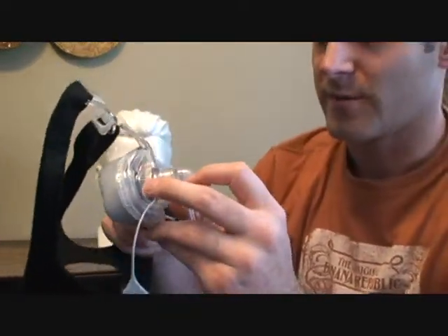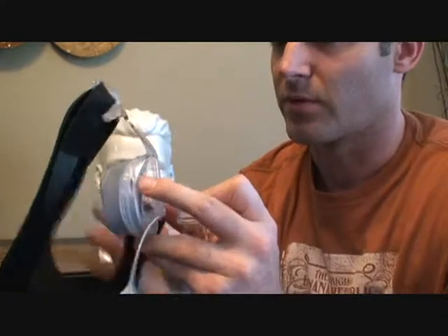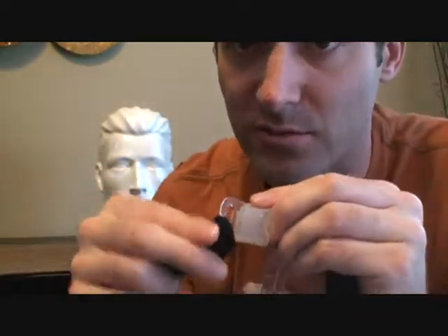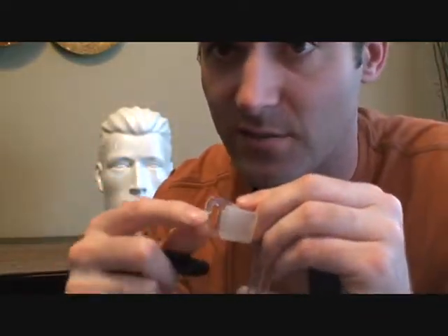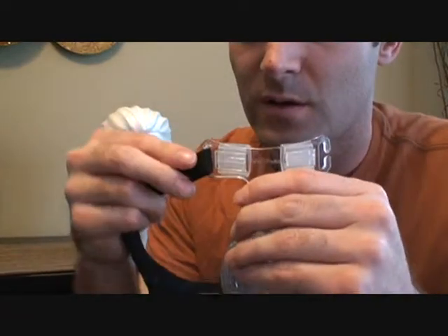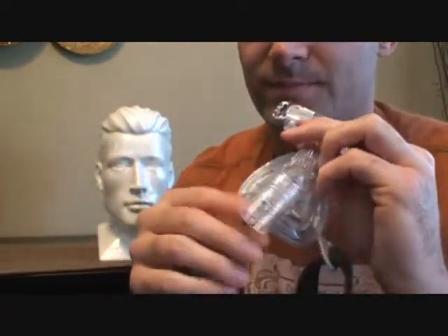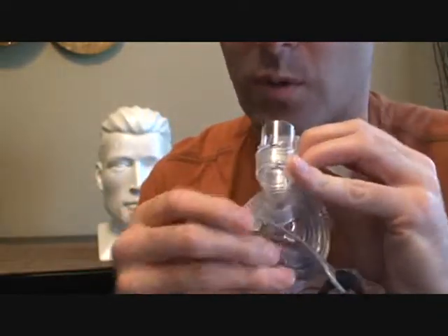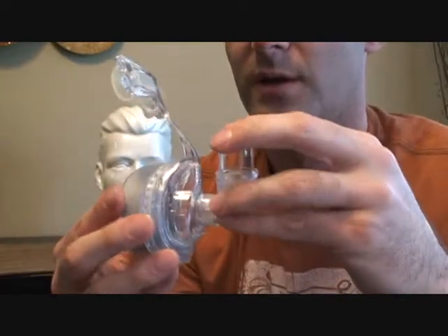So if you wanted to take this mask off to do a deep, thorough cleaning, you don't actually have to take the headgear off per se by undoing the Velcro. This has little grooves in here that the mask slides out of. You can see the groove here. Pull this down, slide it out. And this bottom part, there's these little clips that hold this wire in. That comes off. So now the headgear is completely off.